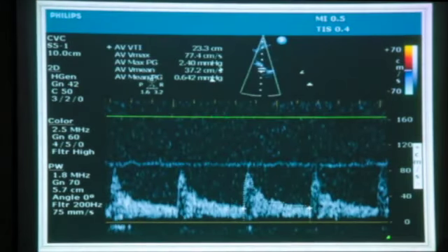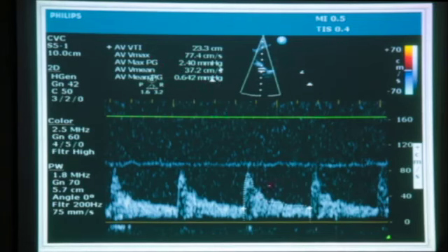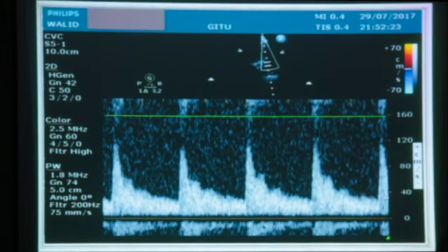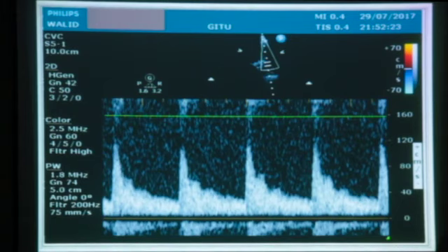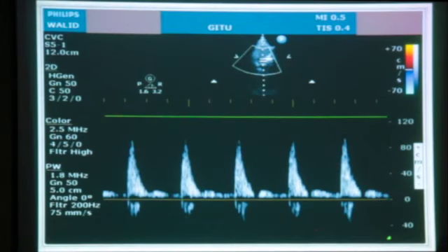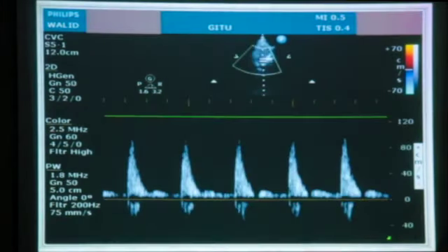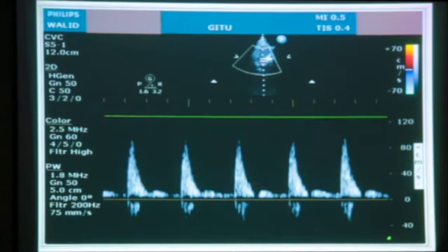A patient showing normal values: mean velocity of 46 cm/s, within the normal range of 45 to 86. This is an older patient so slightly lower is expected. Another patient shows systolic of 120, diastole of 35. If diastole drops below 30 to 35, that is a poor prognostic sign — brain perfusion should remain constant throughout the cardiac cycle because it is a low-resistance circulation. If diastolic flow is almost zero or very low, this patient is highly susceptible to brain ischemia. Check for an underlying cause urgently because cerebral ischemia can develop within minutes.